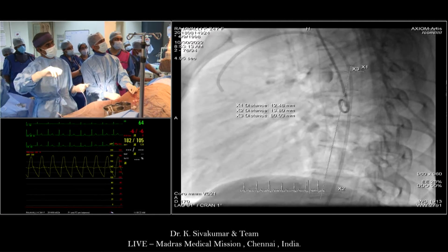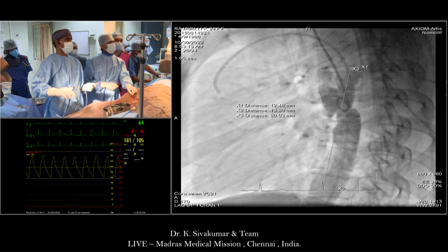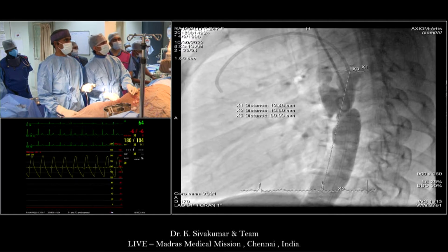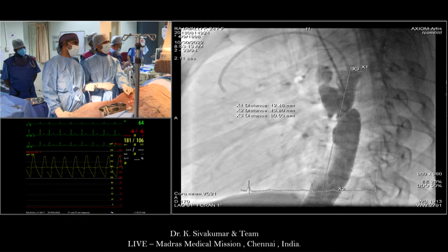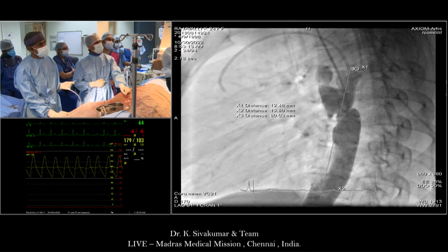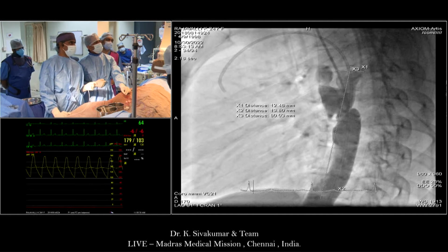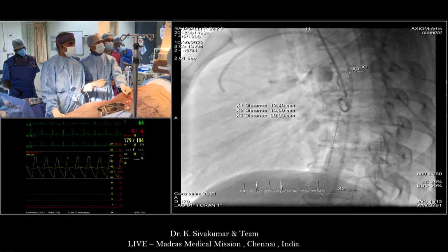Freeze it when the aneurysm is shown. Yeah. So keep moving forward. So it is like a very multiloculated saccule in front. Again, we were having about 13 millimeters proximally, 14 distally with a length of 8 centimeters. Aortic aneurysm, abdominal aorta.